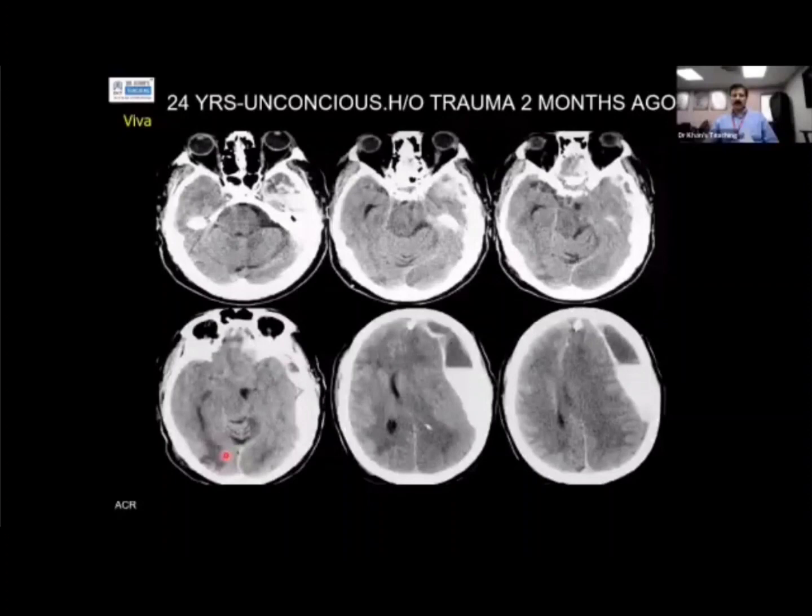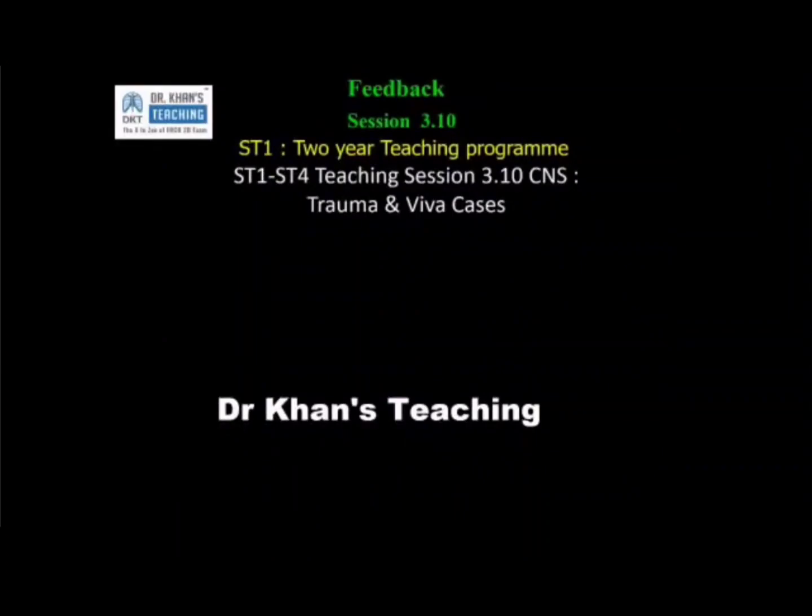And in exam cases, you might find some hemorrhage in the brainstem, in the pons or the medulla. And that is, you remember, Duret hemorrhage. So please, description as well as complications. And the complications can be development of hydrocephalus, any infarctions, Kernohan's notch, or Duret hemorrhages and things like that. Okay. Right. Yes. Okay. Now I have got a few DICOM cases which I am going to show you.